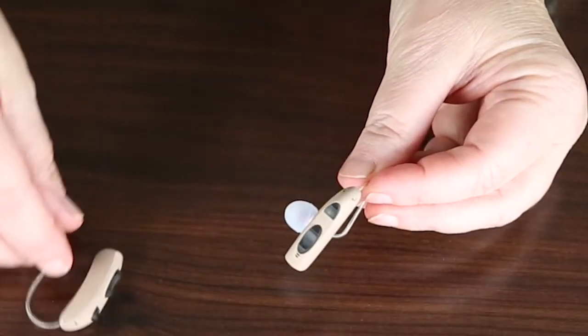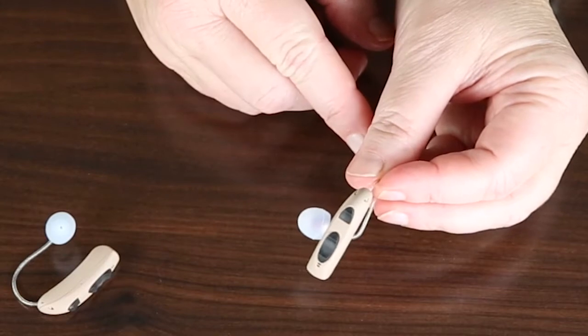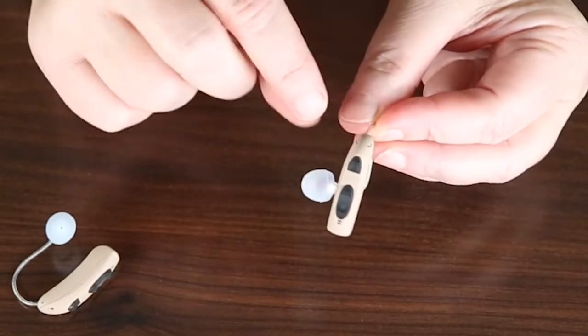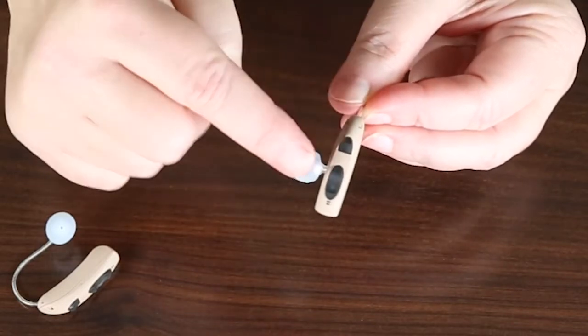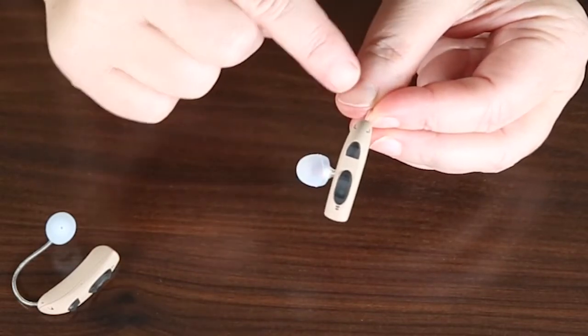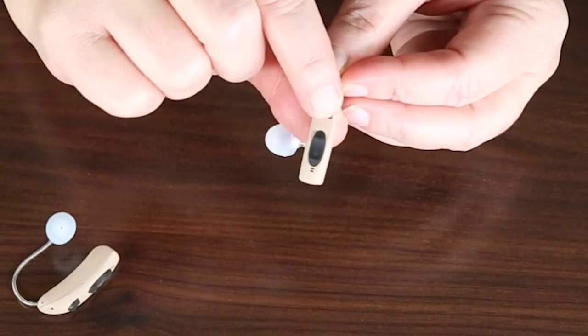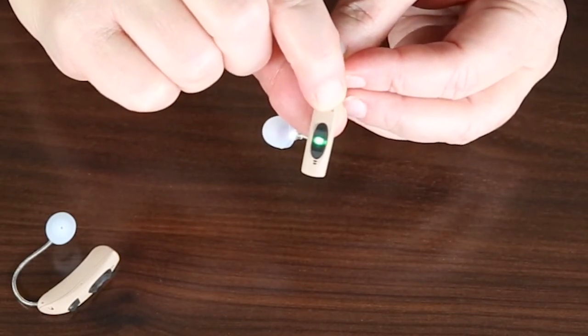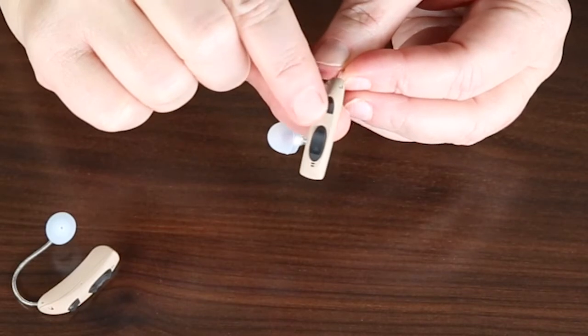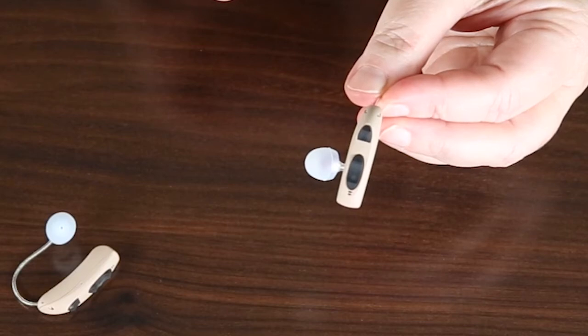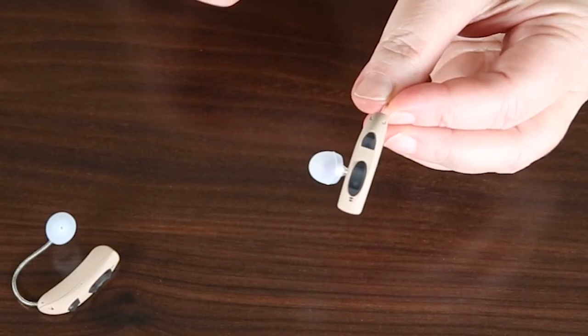The hearing aids themselves feature buttons on the back of the device. You have a power button and you have volume up and down. To access the power button and turn the hearing aid on, you will press and hold for three seconds. At this point you will see a green light. The green light indicates the hearing aid is on.